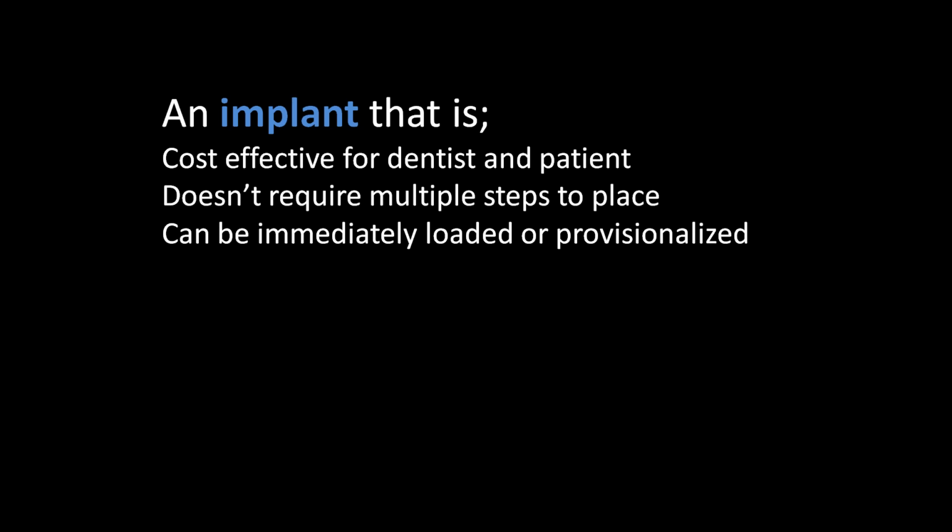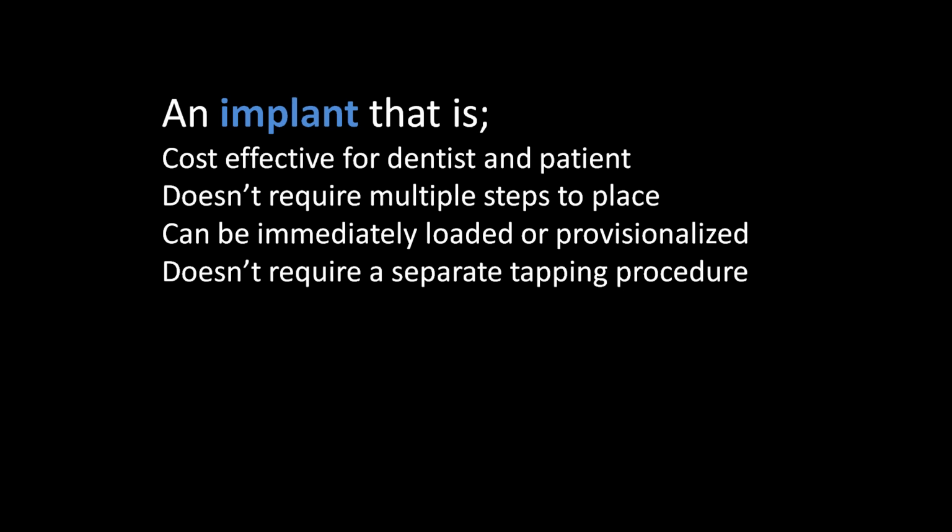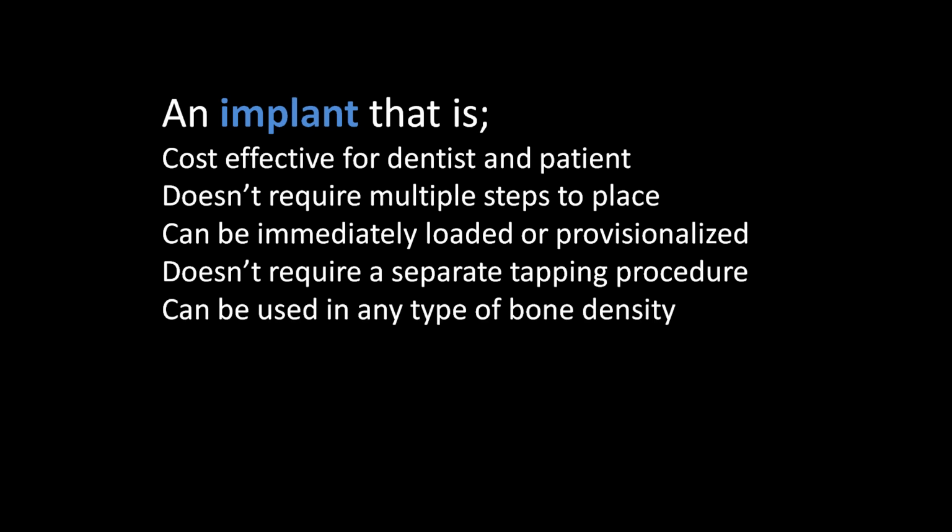Most importantly, our society wants an implant that can be immediately loaded or at least provisionalized. We as dentists want that to be at least progressively loaded or immediately loaded. We don't want to have a separate tapping procedure. We want an implant that in fact is self-tapping. We also want an implant that can be used in any type of bone.